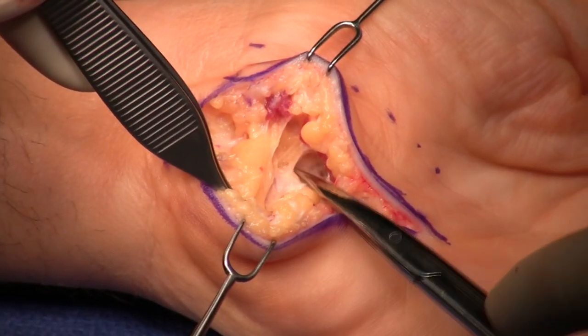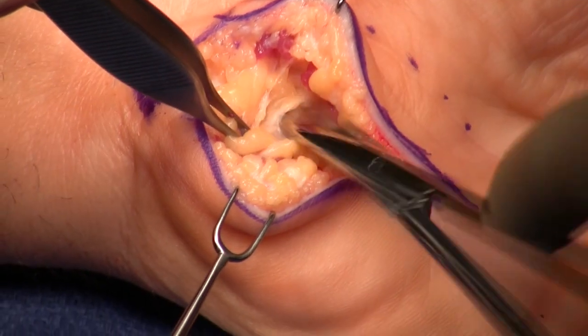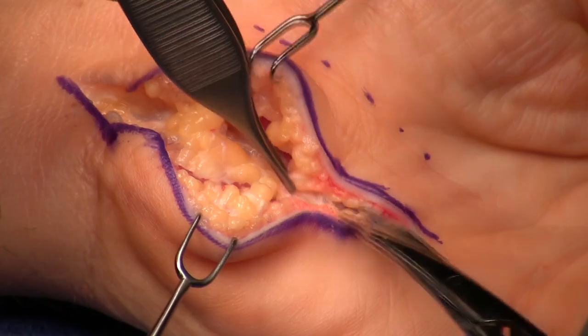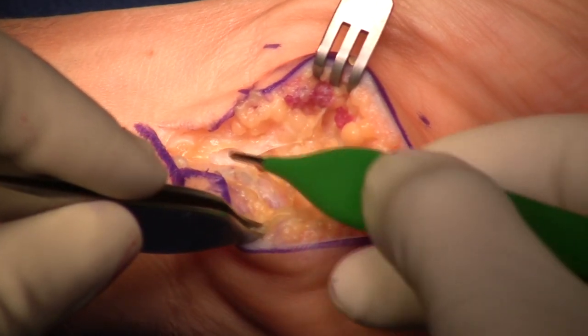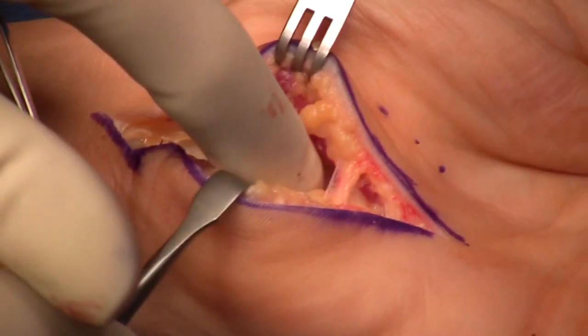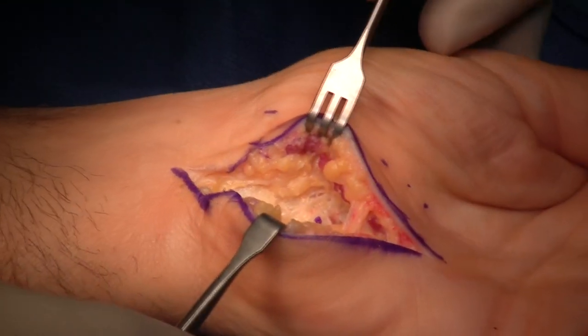My next step is to sweep the ulnar vessels and the ulnar nerve medially. So I open up Guyon's Canal, protect that cutaneous branch, and then sweep the ulnar nerve and vessels medially — everything goes medially. My next step is to feel the hook of the hamate, and I've marked the hook of the hamate with that ink spot.